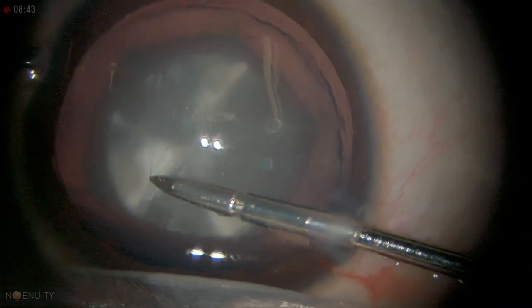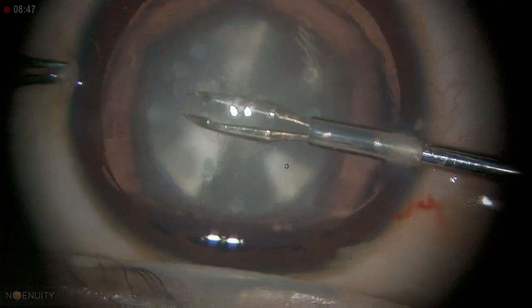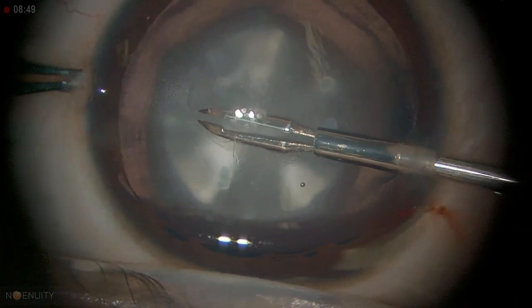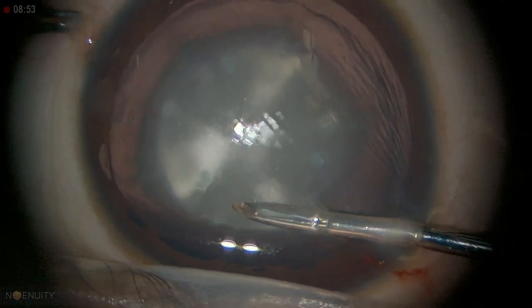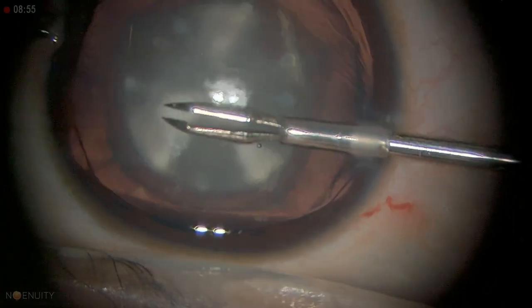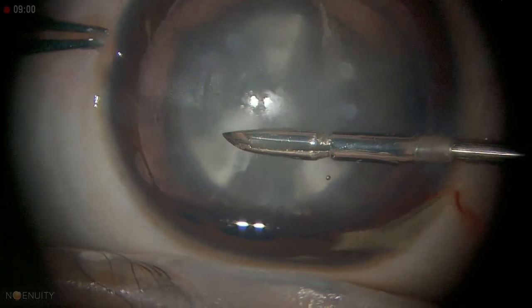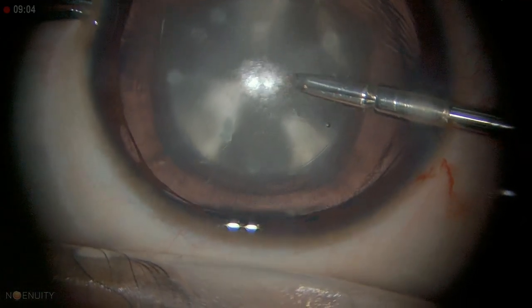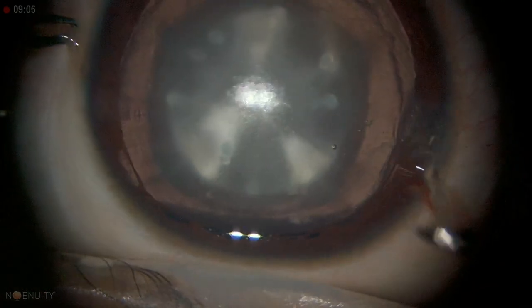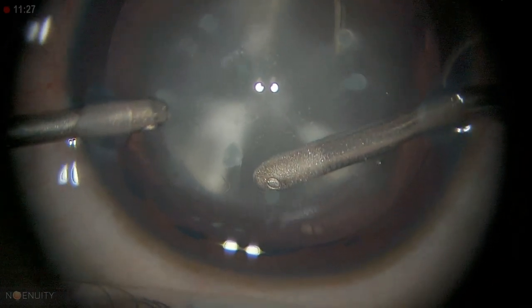We don't expect much extension at this age — they are more elastic compared to adult cataract surgery. They can run away very easily. As in this case, when they are older it is not so much elastic. I generally don't do hydrodissection; in most patients it is not required.